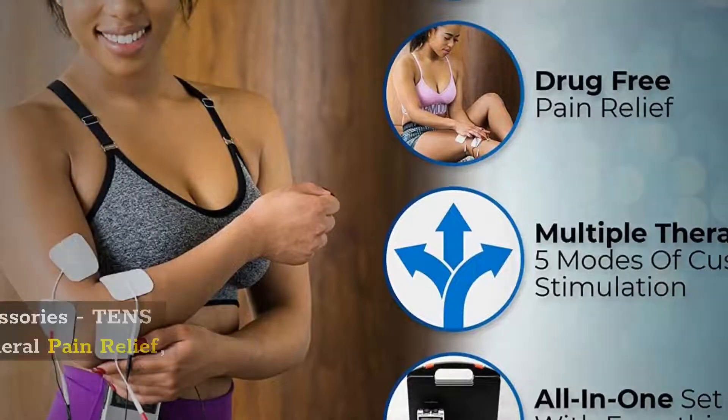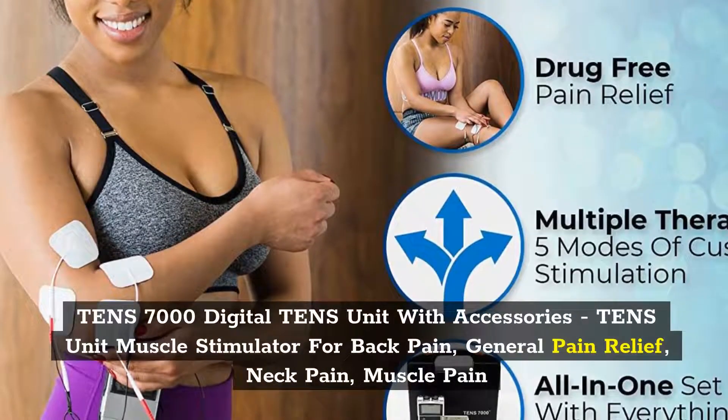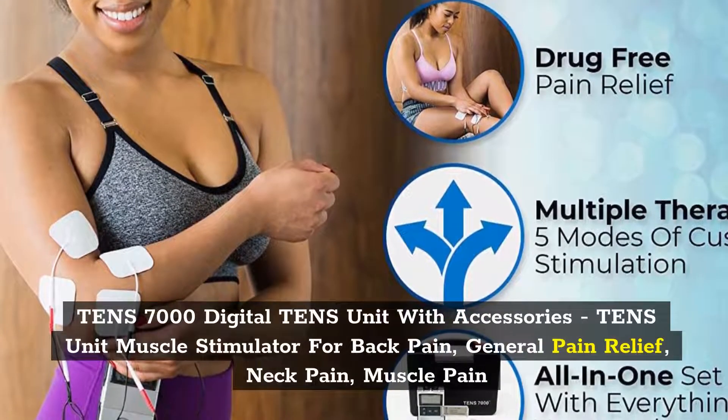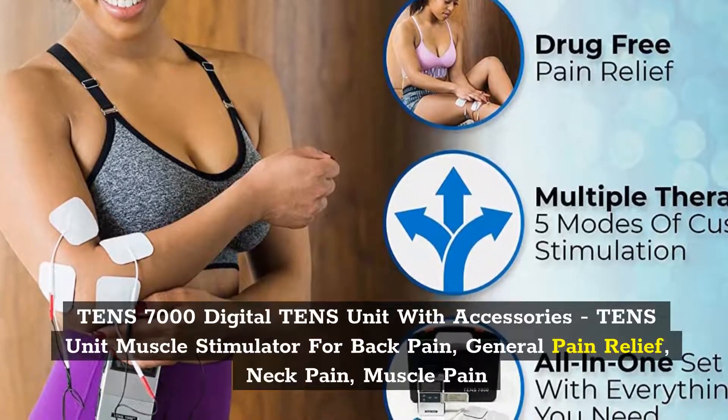Number 2: TENS 7000 Digital TENS Unit with Accessories, TENS Unit Muscle Stimulator for Back Pain, General Pain Relief, Neck Pain, Muscle Pain.